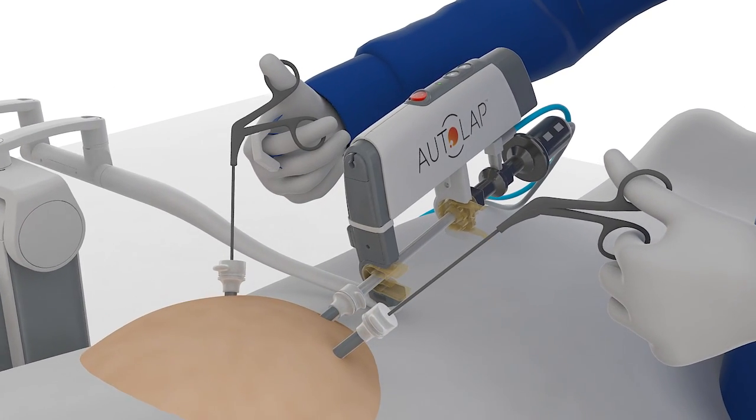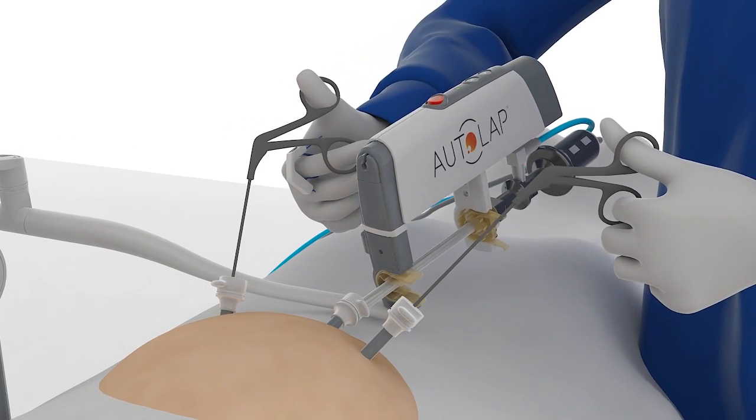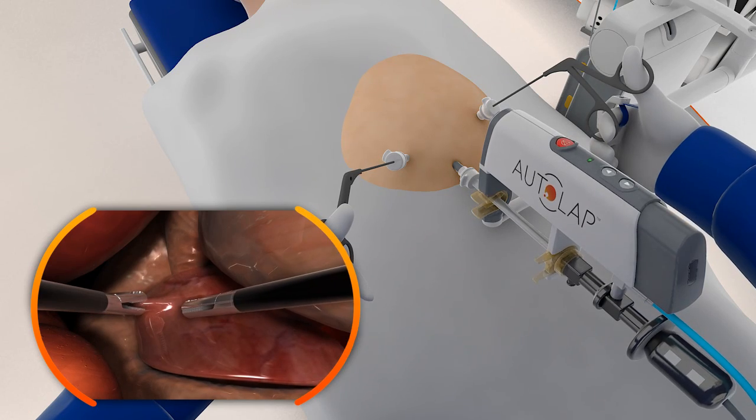The system is comprised of a small footprint laparoscope positioner, a disposable wireless control unit, and embedded image analysis software.